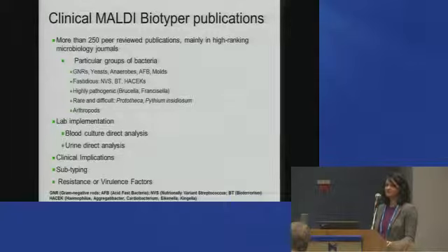The other papers that have been coming out are on lab implementation, as to how to implement these types of methodologies. Because remember, we are a culture-based science. We know how to work with RNA and DNA. Now, all of a sudden, we're in the realm of mass spectrometry. We're dealing with chemicals and different aspects of safety in the lab, which probably comes inherent to you since you're clinical chemists. But for us, we really do have to pay attention to some of these differences that are now coming our way with mass spec.